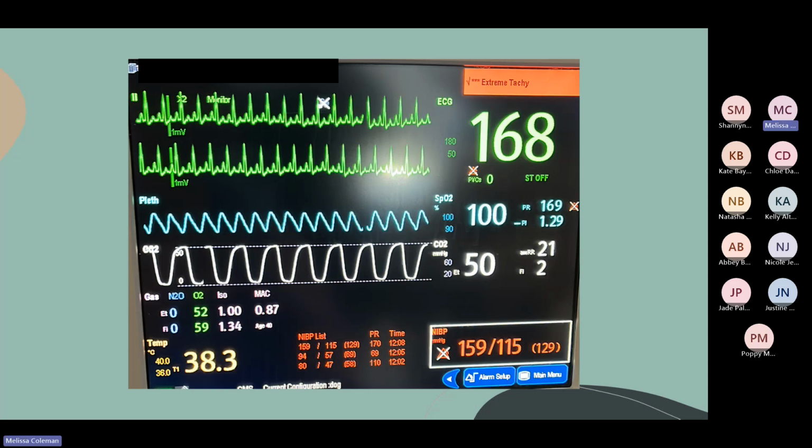What does systolic diastolic mean? We're going to aim for normal. This is probably a little bit hypertensive, which you can see. Initially, with the heart rate, because it goes up so quickly, they will get a little bit hypertensive, and then it should go down.